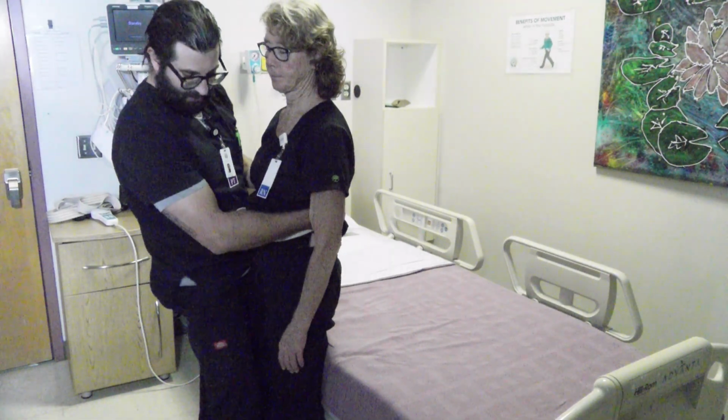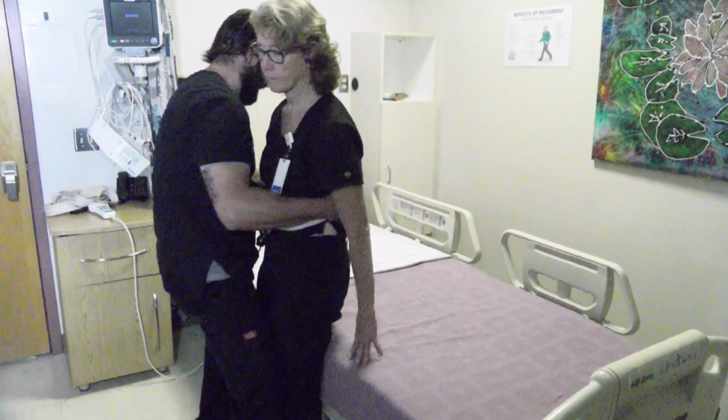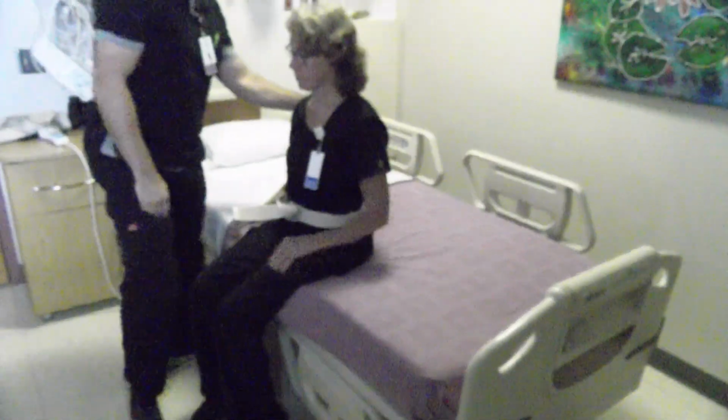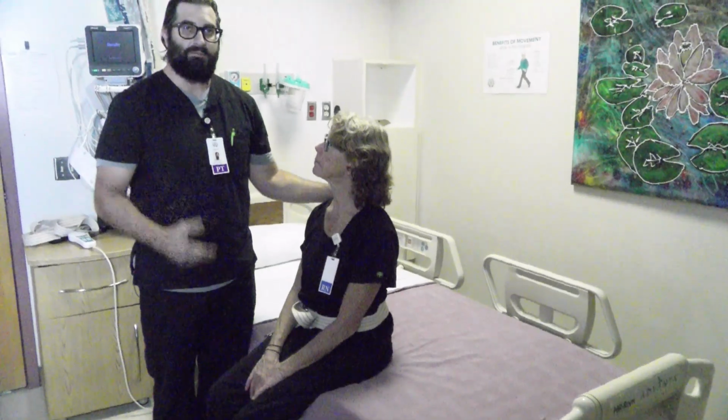So, Miss Patty, would you reach your hands back? We're going to sit down. 3, 2, 1, down. And that is a demonstration of the proper use of a gait belt on a sit-to-stand maneuver. Thank you.